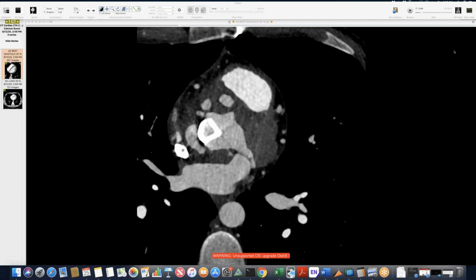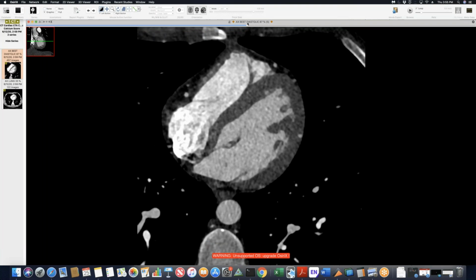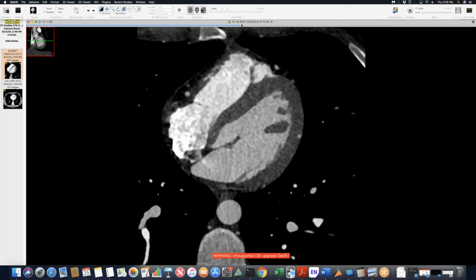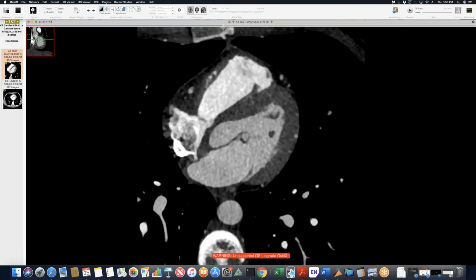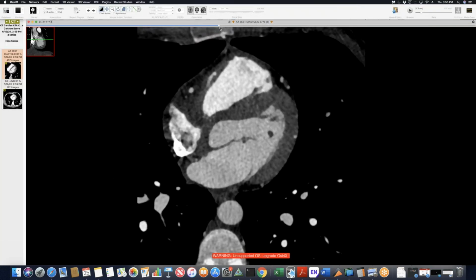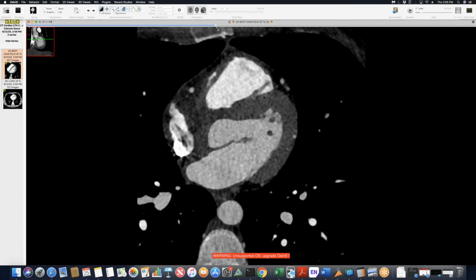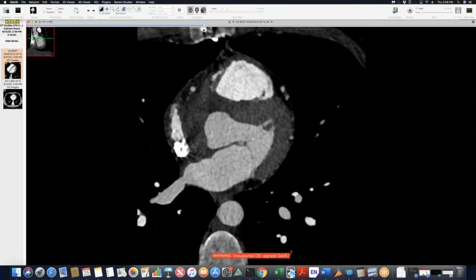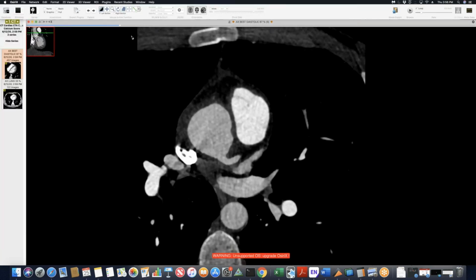This is a young patient who is 26 years old, and in January of this year, they had a mechanical aortic valve replacement at an outside place for aortic insufficiency. Just after the surgery, they just didn't feel good. Not extremely sick, but general exhaustion and multiple palpitations, and then came into our institution a few weeks ago, and there was concern for perivalvular leak, and so this is the CT that I read. As we go to the aortic root, there are multiple abnormalities here.